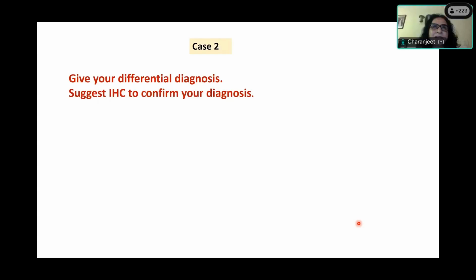Ma'am, to differentiate whether these cells are of thyroid origin or mesenchymal, we should order TTF1. Okay, TTF1. You also talked about anaplastic and medullary carcinoma. Yes, ma'am, medullary. What would you like to do?